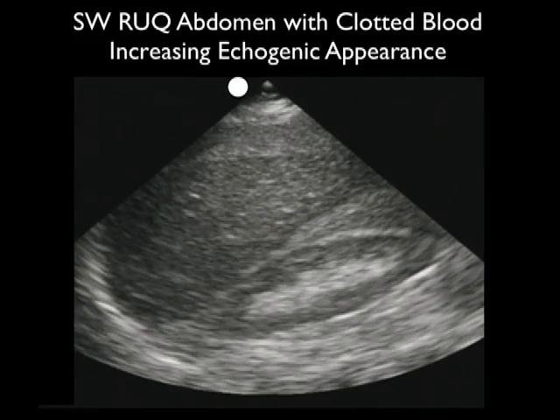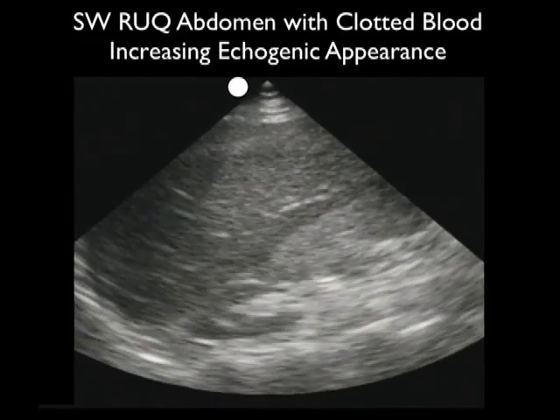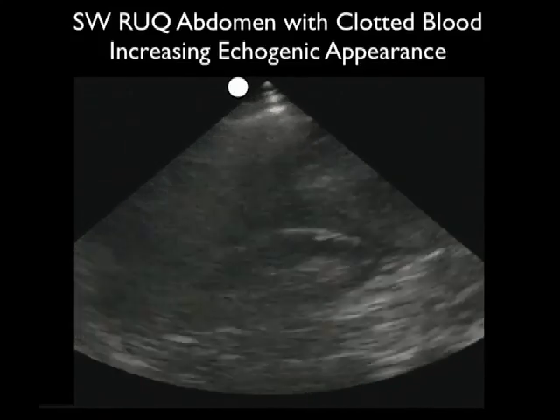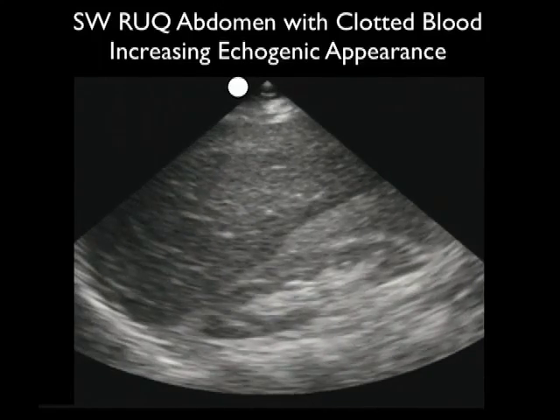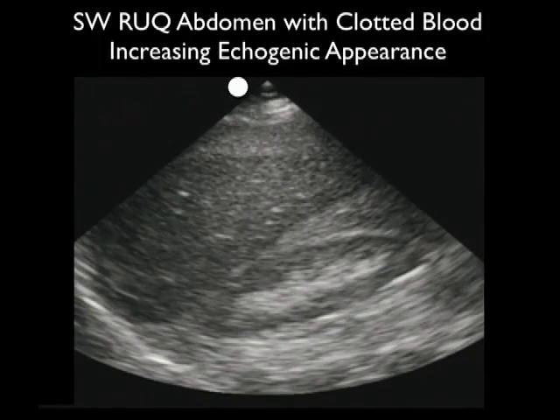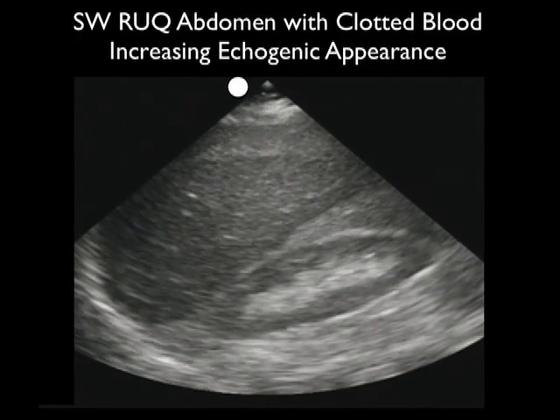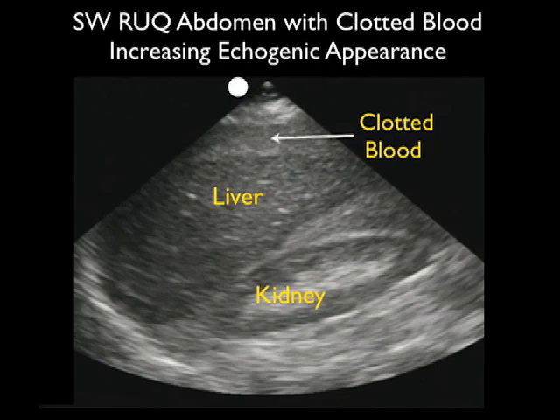However, as blood clots, it can take on a more echogenic or lighter appearance. In this video clip, a patient was stabbed and had a significant downtime before being brought to the emergency department. As we look at the hepatorenal interface, we see a large amount of clotted blood there, made up by that echogenic or lighter appearance of the blood. Notice that the large amount of blood extends into the right paracolic gutter as we scan inferiorly. And here we can see the liver, the kidney, and the clotted blood, that more echogenic or lighter blood, in Morison's pouch.